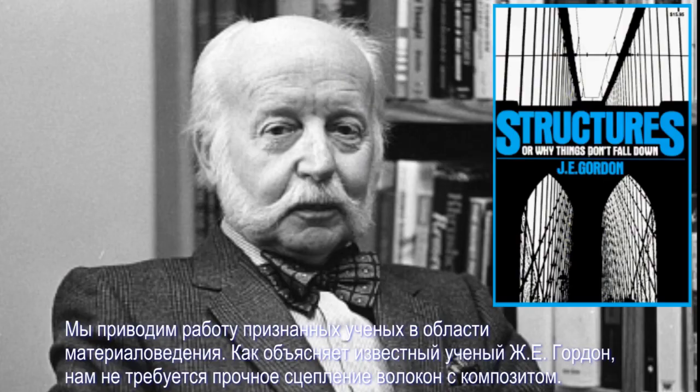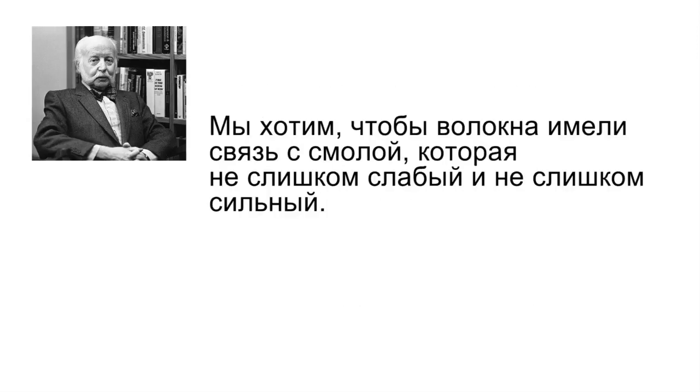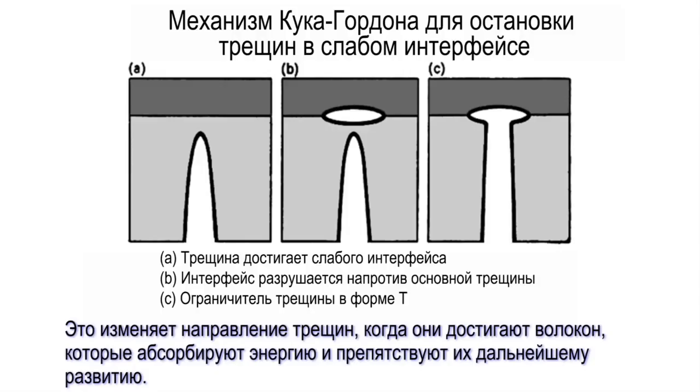We refer to the work of recognized material scientists. As the famous material scientist J.E. Gordon explains, we do not want too high of a bond strength of the fibers to the resin. Although having high bond strengths might increase the flexural strength of the fiber reinforced structure, it has the very unfortunate side effect of creating brittleness. J.E. Gordon explains that we want the fibers to have a bond to the resin that is not too weak and not too strong. This allows cracks to deflect when they reach the fibers, which absorbs energy and prevents the rapid propagation of the crack.